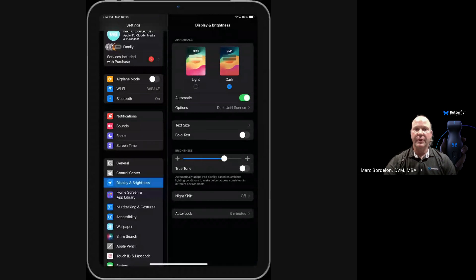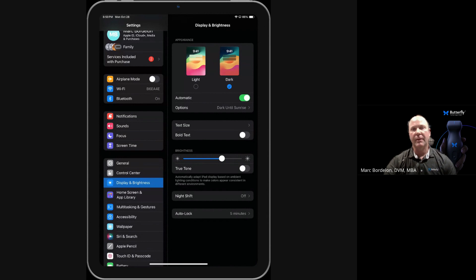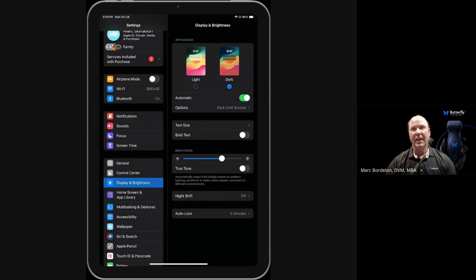The first one is going to be the brightness. What we don't want is the brightness to be maxed out or too low. We want it about two-thirds of the way up. That's what the manual recommends, and that's what's going to help adjust the gain best once we get into the Butterfly app.